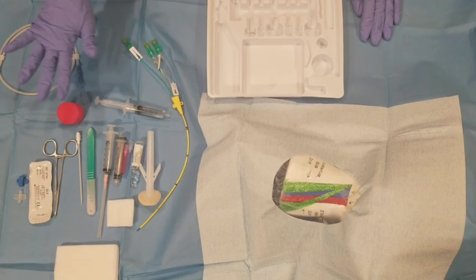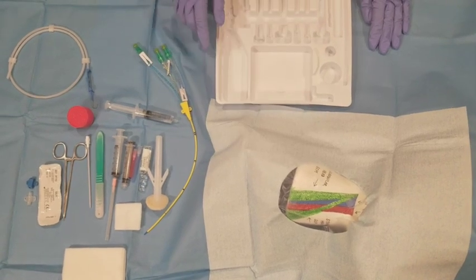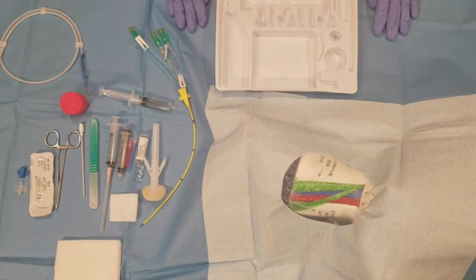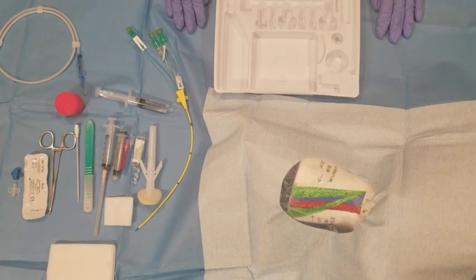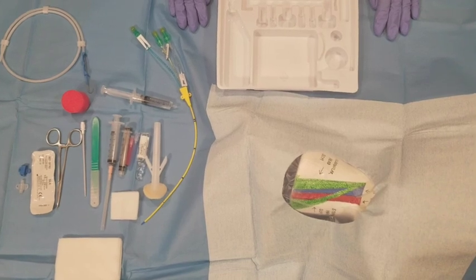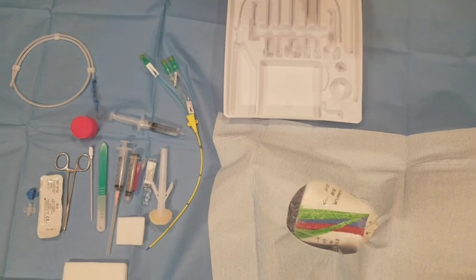We have our materials all laid out in order. We have our patient here covered with a sterile drape, and we're ready to go. Obviously, all of this will be done under sterile conditions. It would be fully draped in a sterile gown with sterile gloves, but for the purposes of this demonstration, I have just put on a regular pair of gloves just to show you.